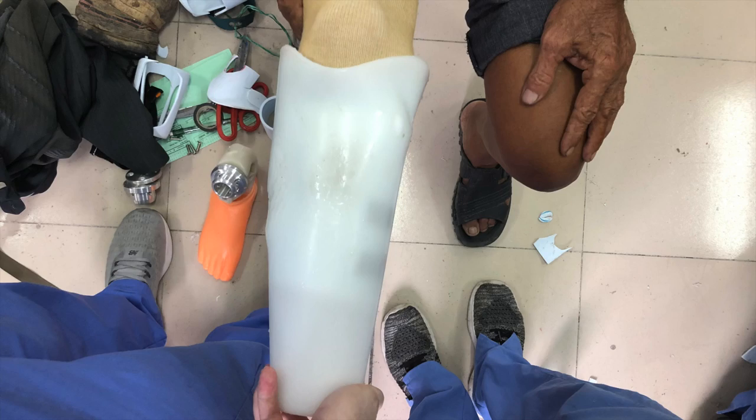The patient then complained that the socket was a little loose around the distal aspect of his stump, so we added some scrap foam to make it more comfortable. As you can see, the valgus is now corrected and we can move on to getting the patient to weight bear.